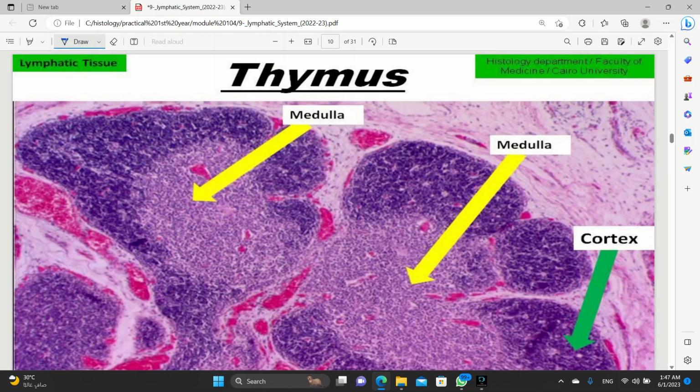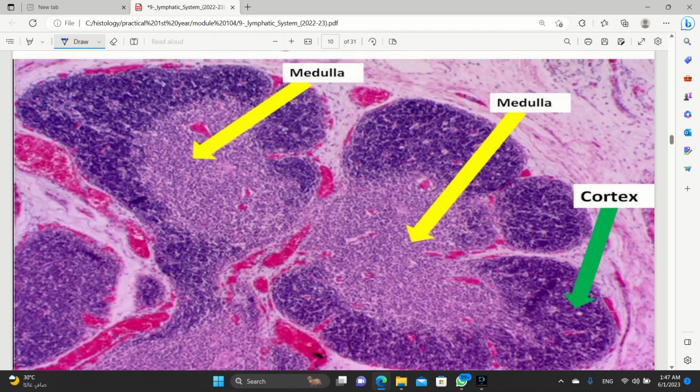Okay, again. I can see something that is purple and it's segmented, it has a lot of segments into incomplete lobules. Now that's pretty apparent to you. It's segmented into incomplete lobules, and it's purple. Not most of the time purple. I said do not really depend on the color, because as you can see here, by the way, that's a vessel, but that's not the point. As you can see here, it became paler. But we're focusing: the lobules are always purple.